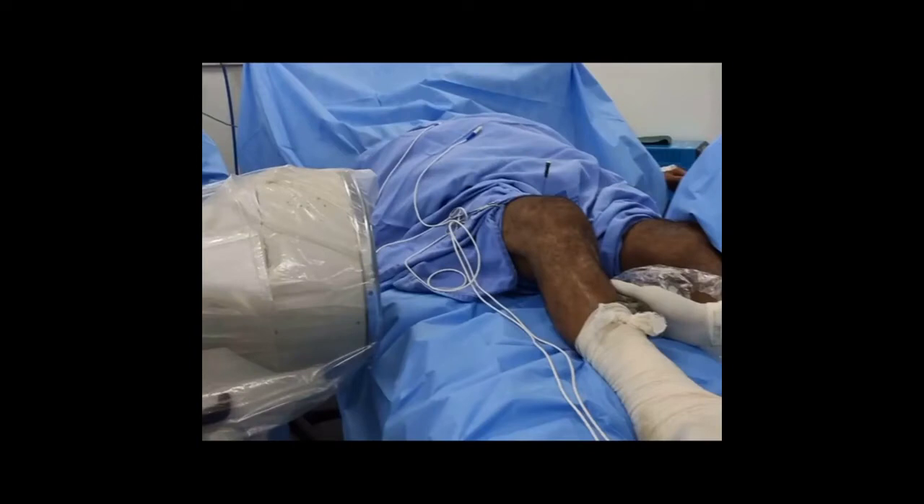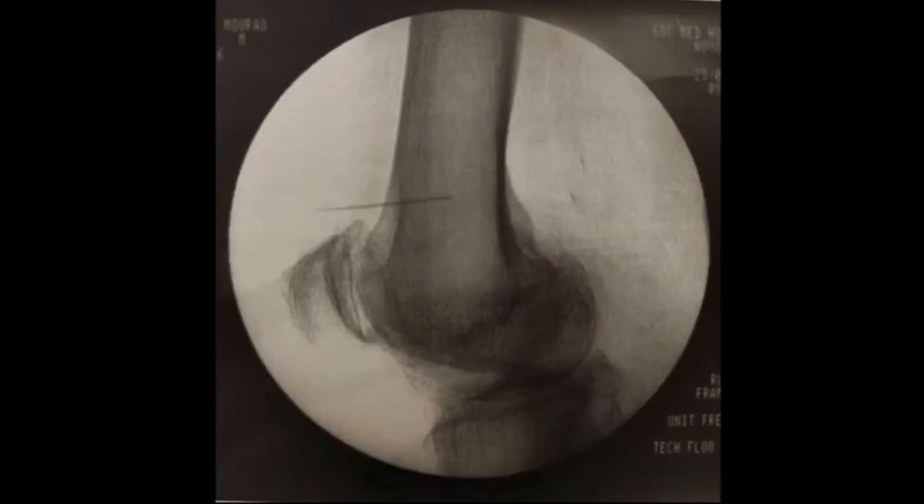The imaging apparatus is then rotated 90 degrees, perpendicular to the long axis of the limb, positioned so that we have an image in absolute lateral view with overlapping of the femoral condyles. We progress with the needle until it reaches the middle posterior third of the diaphysis.